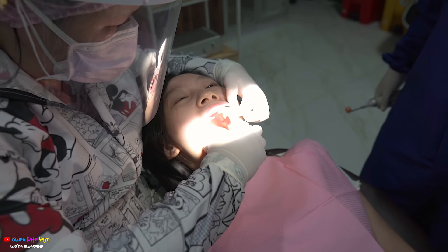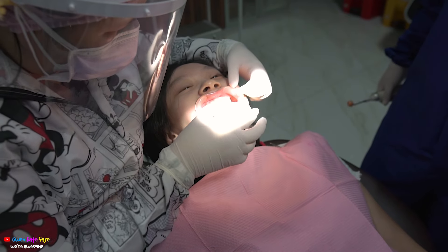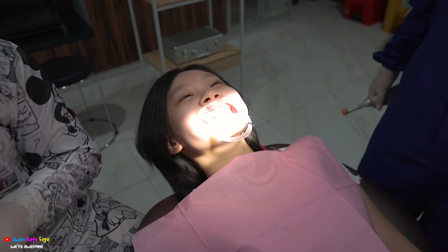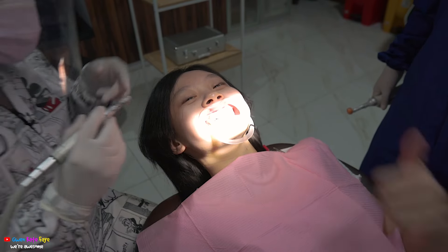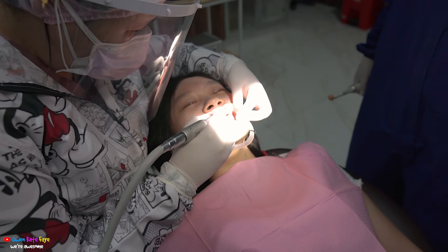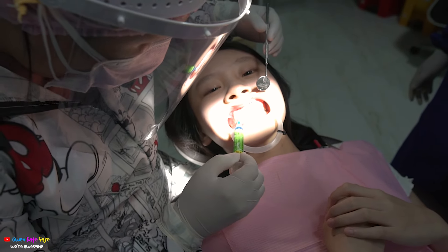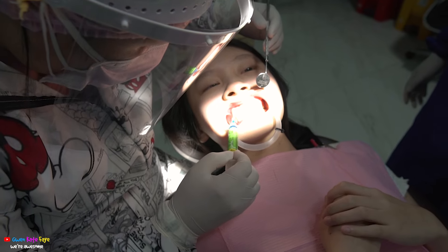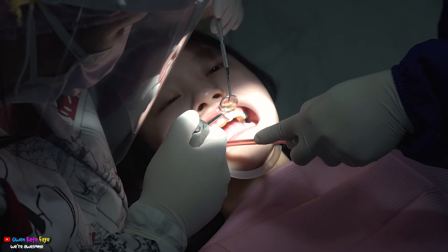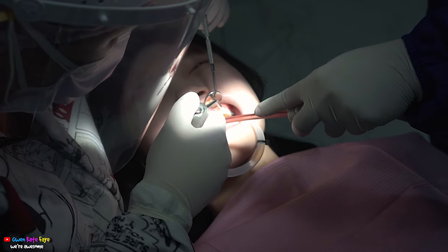So this is process number one and I think the dentist is trying to clean my teeth, or like the pores of my teeth first. As you guys can hear, it's kind of hard for me to talk because I'm wearing my braces. This felt very ticklish. I don't know what this is but it's either the glue or something else. And here's another cleaning because maybe there's still some dirt in my teeth and the dentist wants to make it clean.